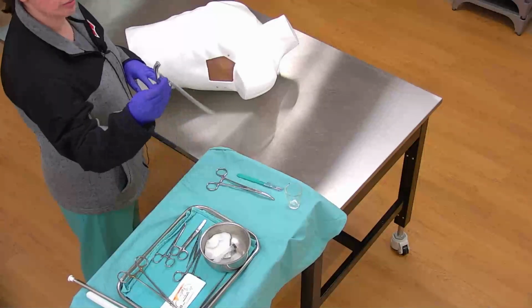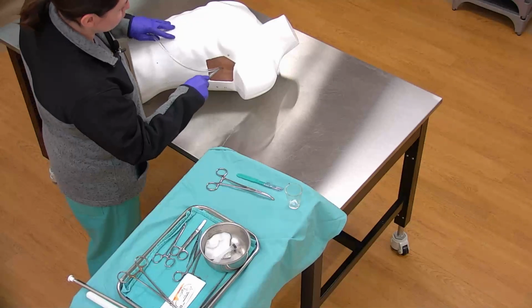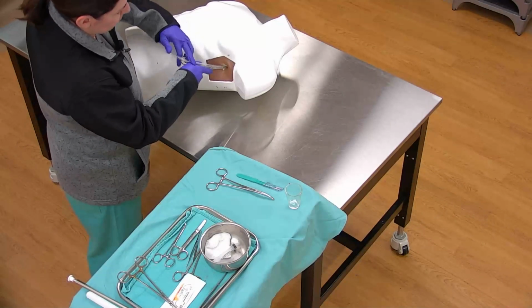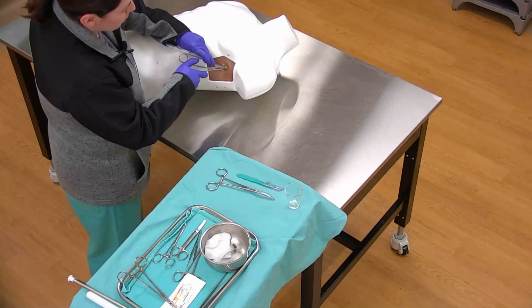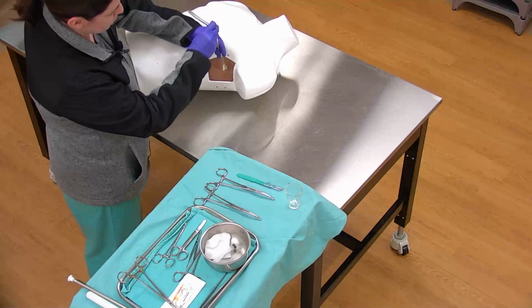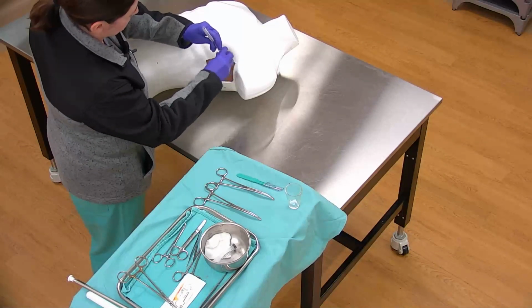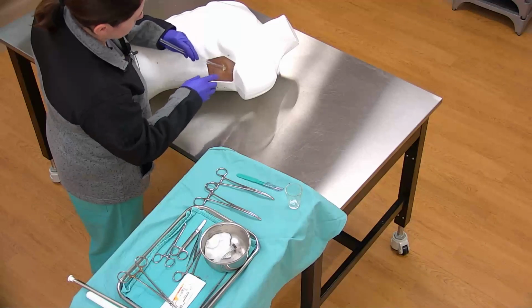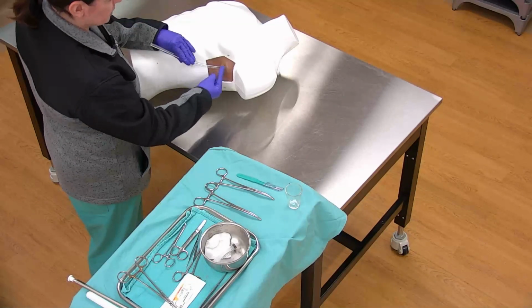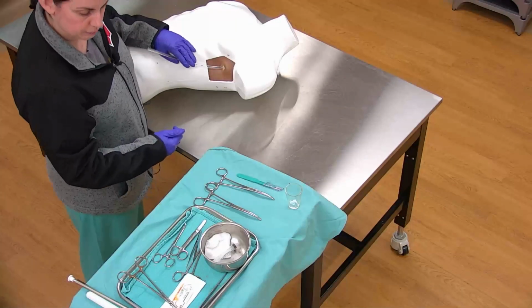Next, take your chest tube and insert it through the hole you just made. Once the tip is in, you can release the clamp while holding your chest tube, and then angle it to the position you want it to be in. Making sure the chest tube is inserted far enough is important. While this is just a mannequin, it doesn't matter much, but for most people, you need it to be inserted 8 to 10 centimeters to ensure all the holes of the chest tube are within the pleura.